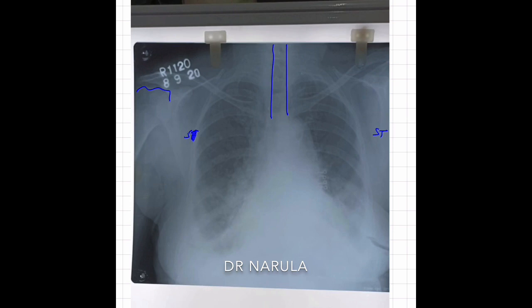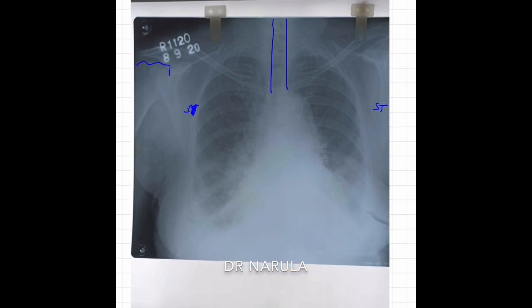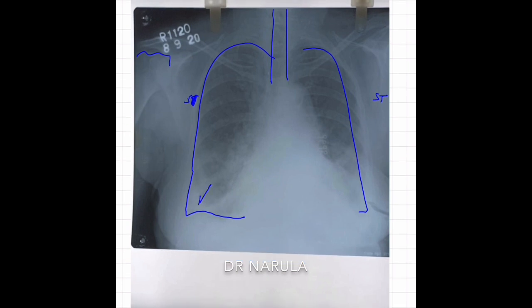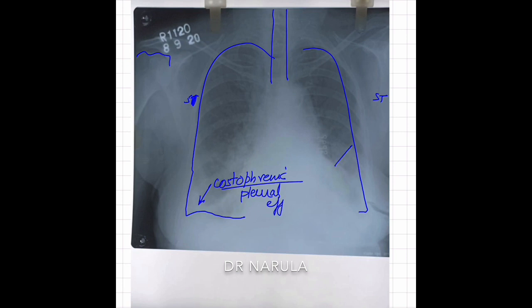Now we go to the thorax proper, and we see that here — you can't make out the lung. Normally the lung should have been visible here, but the angle of the lung with the diaphragm has been obliterated. This costophrenic angle has been obliterated, which is a sign of pleural effusion. And you can see it is on both sides.